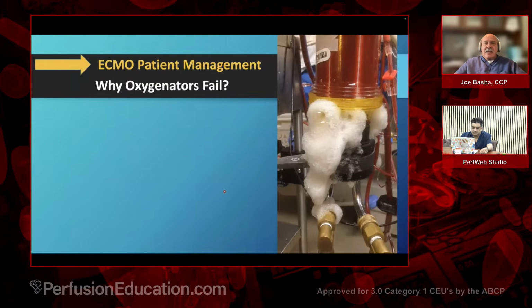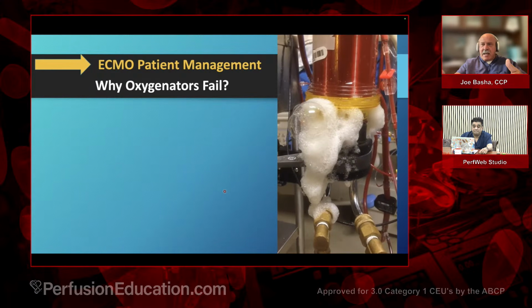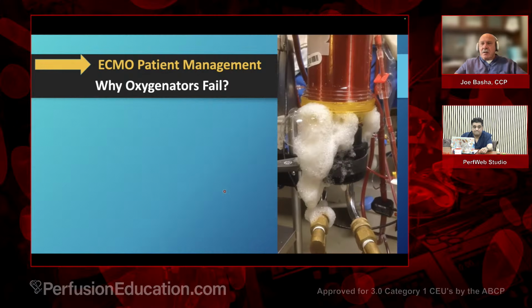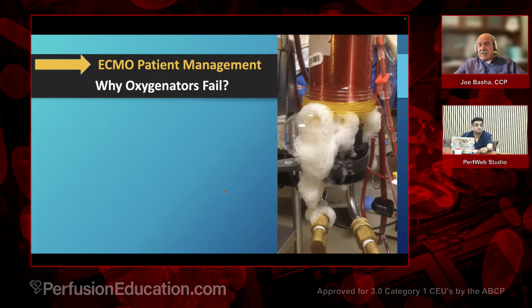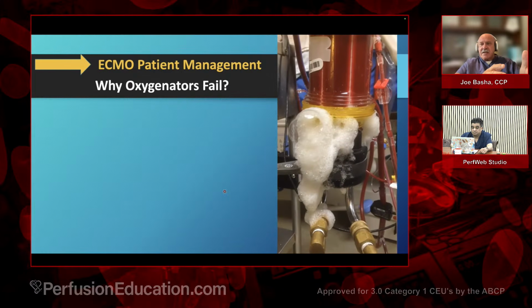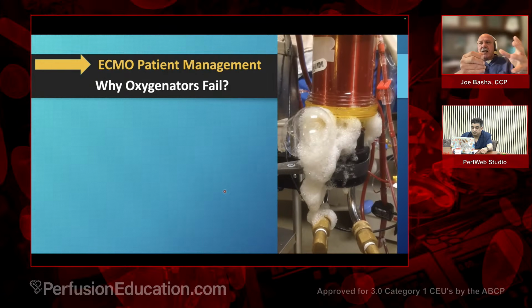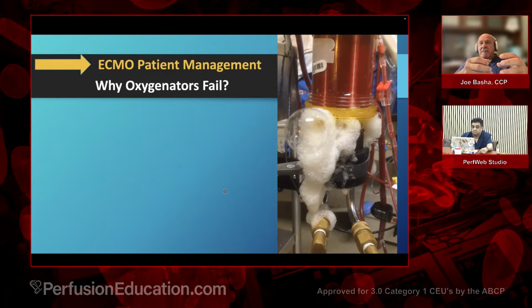So going back to the oxygenator failure, I was talking about this plasma leak. This is a polypropylene fiber. Polypropylene will interact with lipids, something you have to be very aware of. So you have a patient, and you don't have to have them on propofol, but do not use propofol if you're using a polypropylene fiber, because it changes its molecular configuration from naturally hydrophobic to hydrophilic. The plasma water fills the polypropylene fiber, causing it to swell, expanding the hole, allowing plasma to leak out.